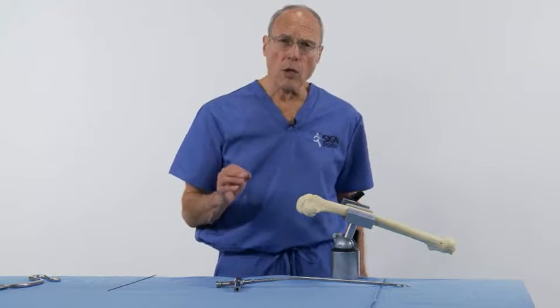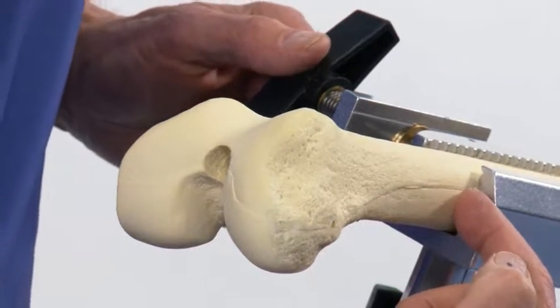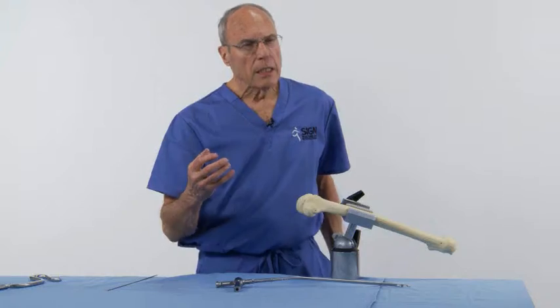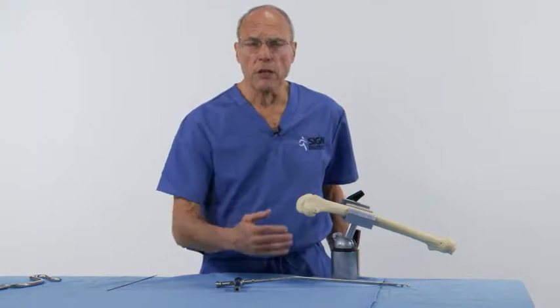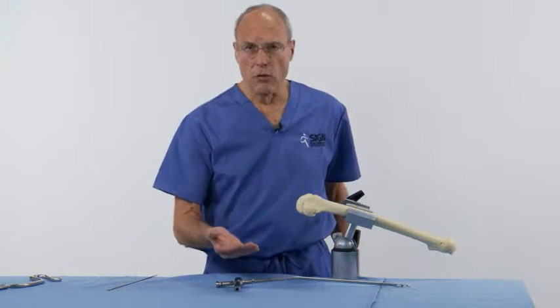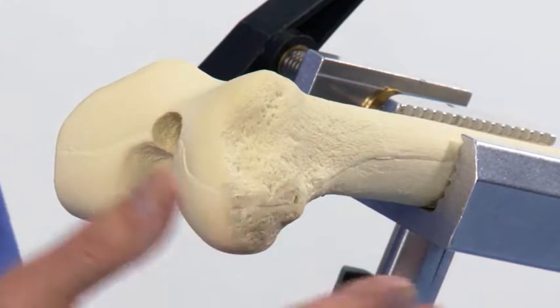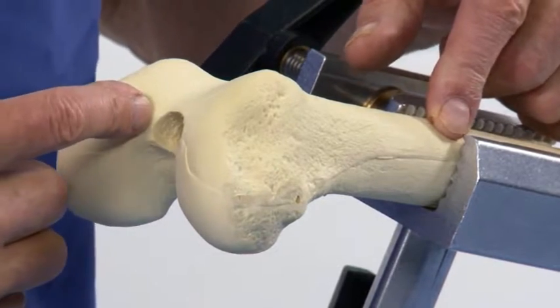If you're going to do an open reduction, there are 3 considerations. The one consideration is if there's no intercondylar fracture, the incision is made in the lateral side. Incise through the tensor fasciae lata and use the periosteal elevator to dissect through the fibers of the vastus lateralis, as you did in the antegrade approach to the femur. After reduction is obtained, look carefully at the fracture site to direct the reamers.